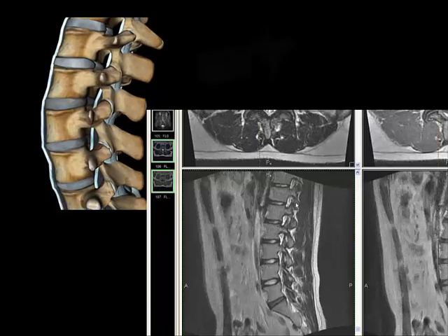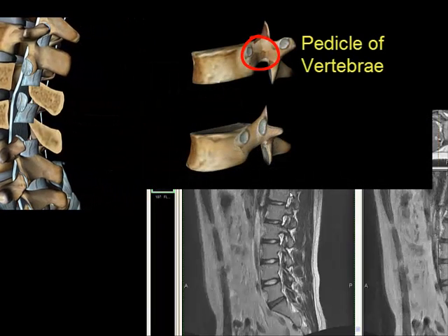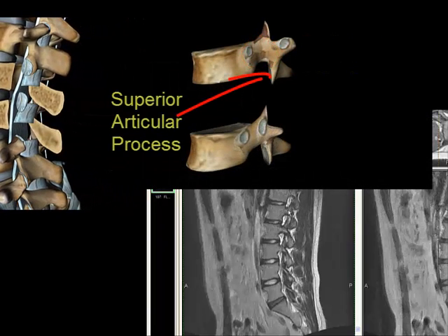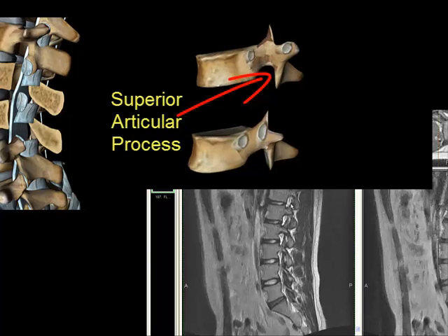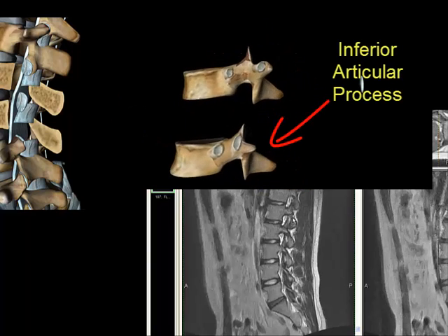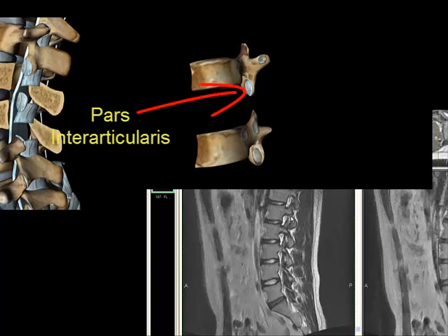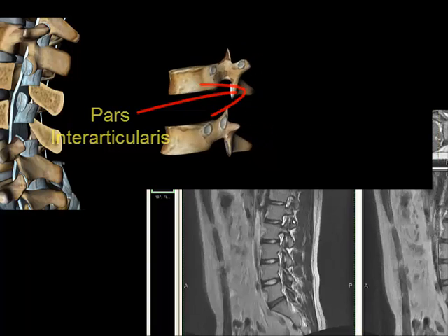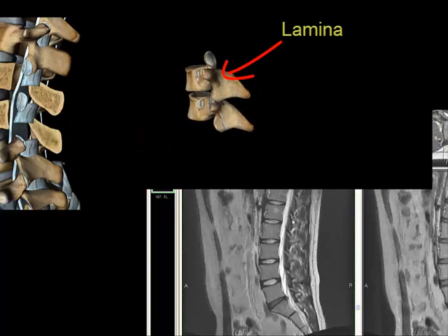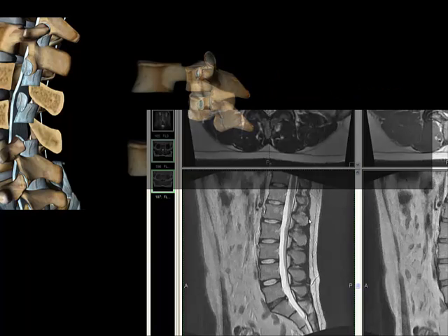As we make our way posterior, you can see the pedicle of the bone here, and then the superior articular process and inferior articular process. In between is the pars interarticularis. And if I go more to the midline, you can see the lamina here, and then here's the spinous process.